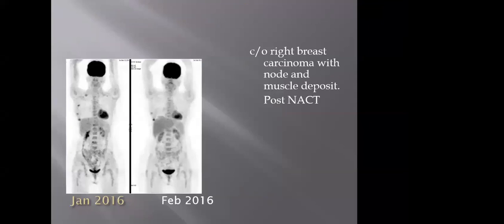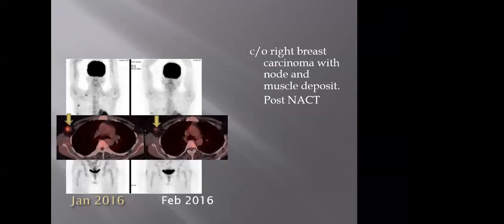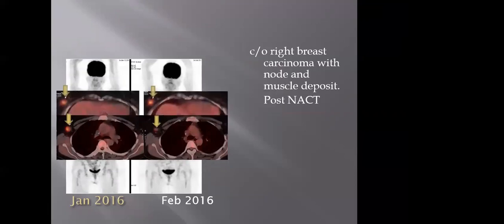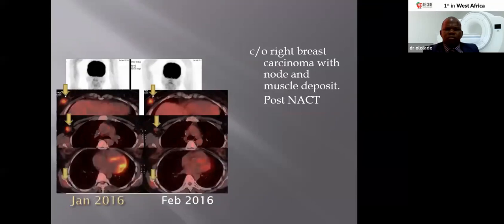Case of carcinoma right breast with node and muscle deposits, post neoadjuvant chemotherapy. Next slide. The disease definitely has regressed compared to the baseline. Next slide. Next slide, please. But there is still sufficient disease left behind. Next slide.